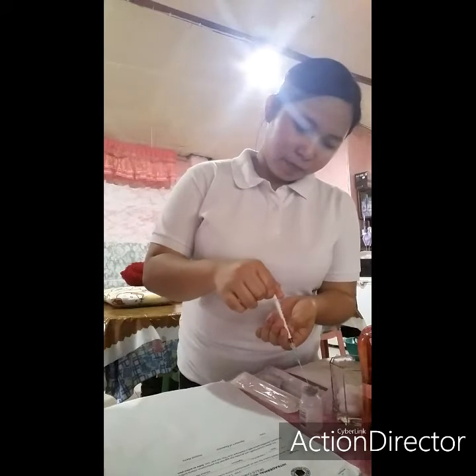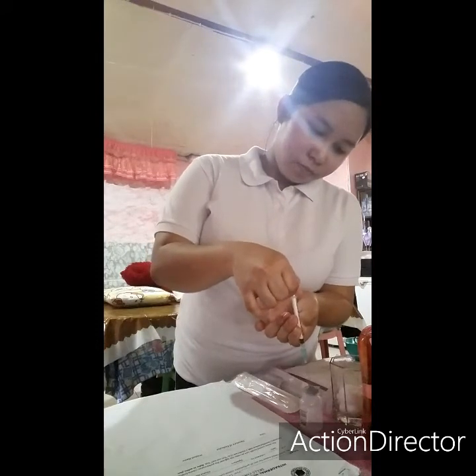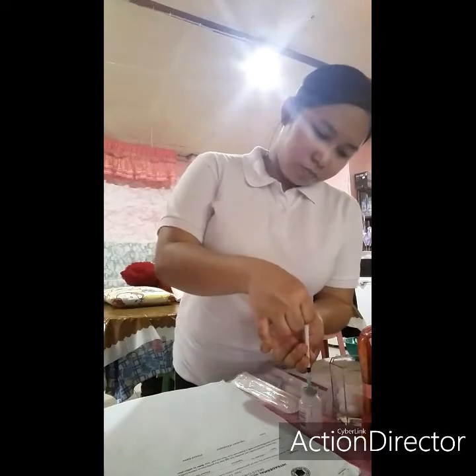Inject air into the vial. Tap, there is some air inside. 0.1 ml.